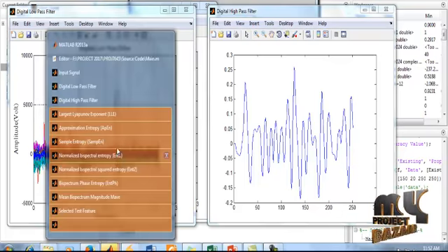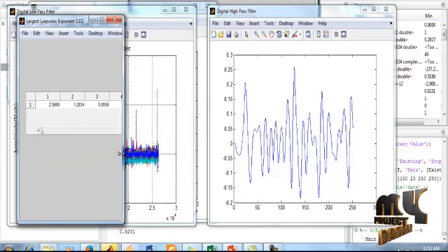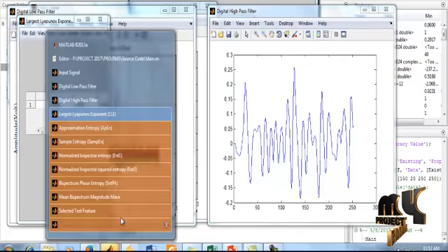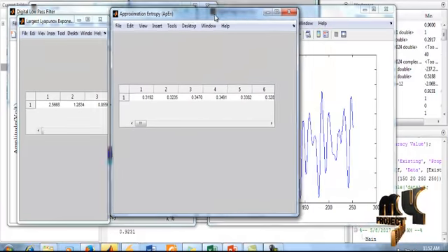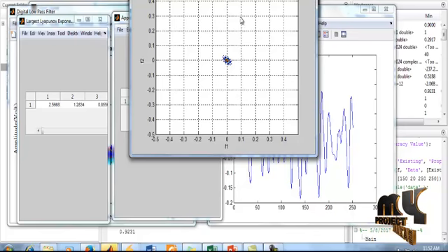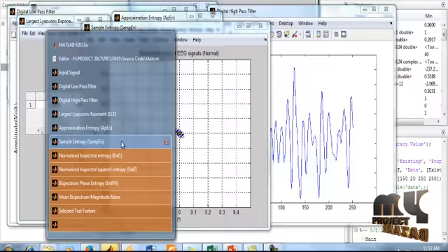After the pre-processing step, the feature extraction is carried out. Here the first LLE feature is extracted and then the values are plotted in the tabulation. Then the approximate entropy, that is the ApEn value, is extracted from the signal and those values are plotted in the tabulation. There are nearly hundreds of features there. After that, the sample entropy features are extracted and then those values are plotted in graph format, hence this feature is well optimized and then plotted in graph format.